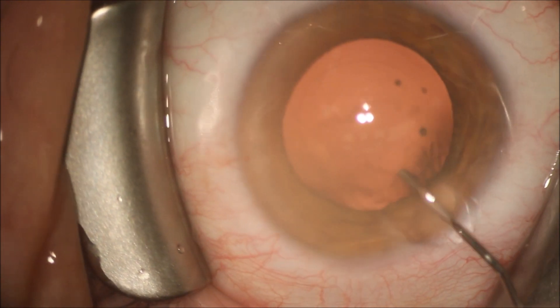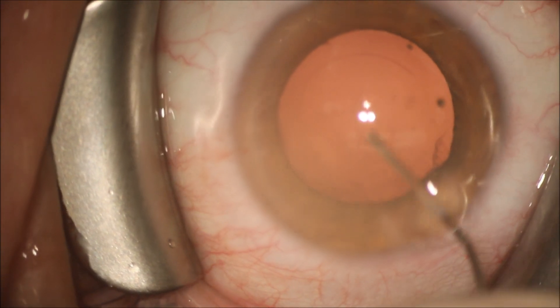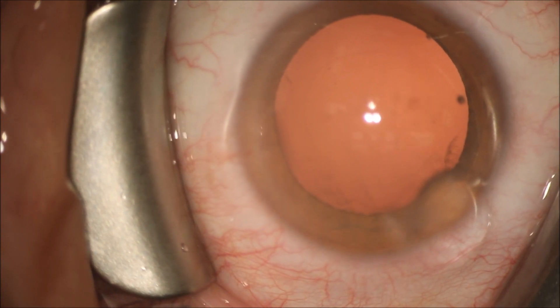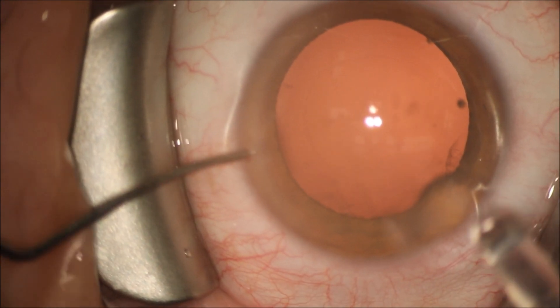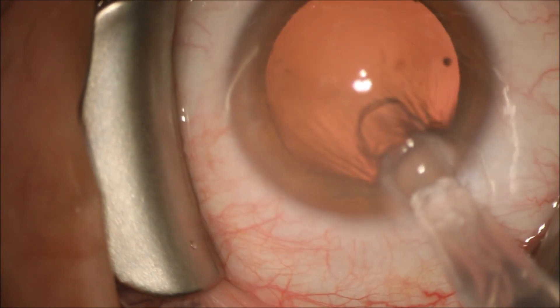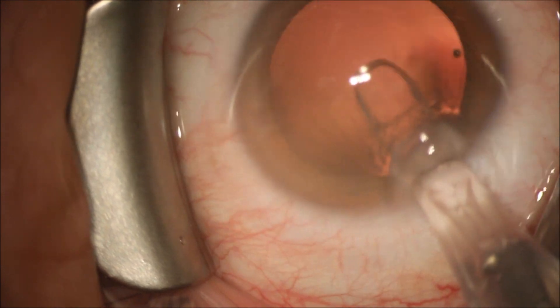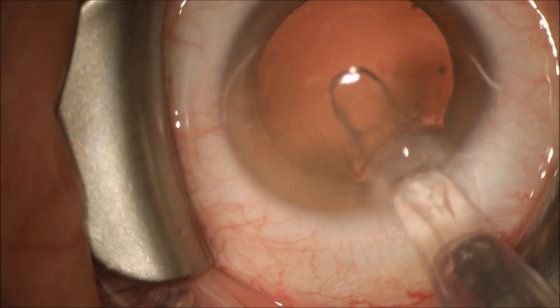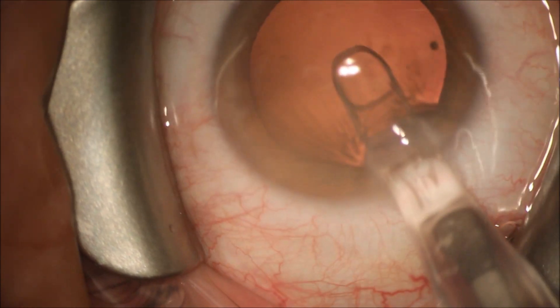Once these attachments have been removed, we inject further viscoelastic to keep space in the anterior chamber and fill the capsular bag. We're going to inject through the main incision on a Monarch injector — a C cartridge — a Tecnis multifocal lens into the capsular bag.